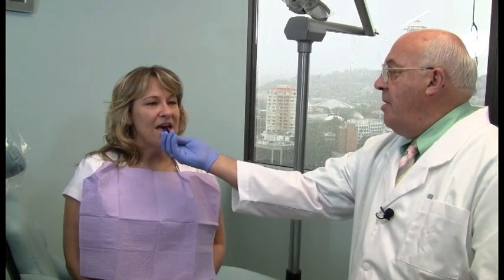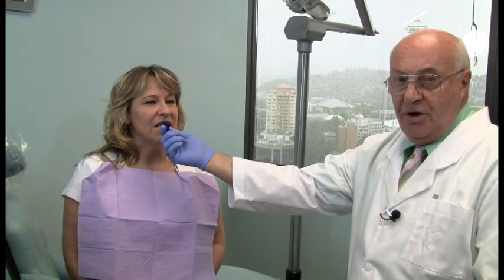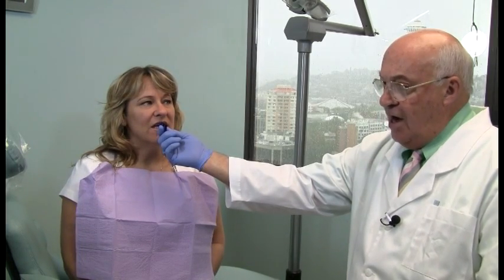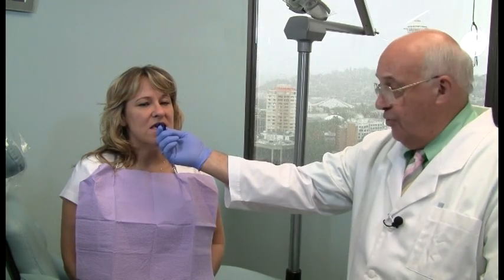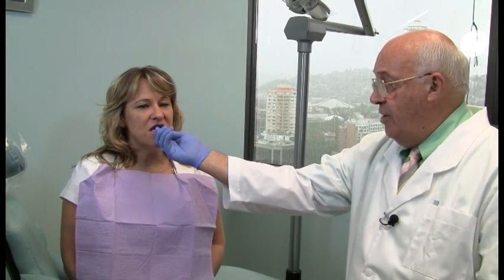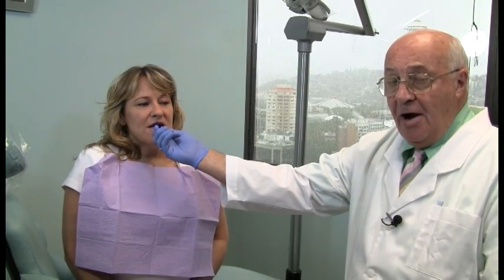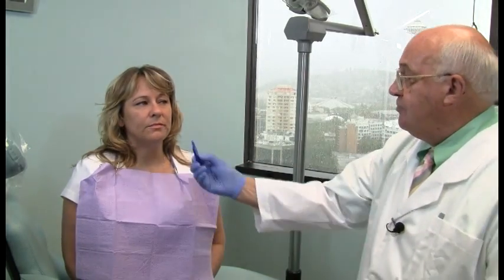We're at end to end, 4 millimeters. Would you snore, please? Okay, that is just a tiny bit better than that arbitrary 5 that we put on her natural snoring. Slide straight forward into protrusive. Okay, that's about a 3. We started with a 5, we're down to 3. This is where lesser is better.